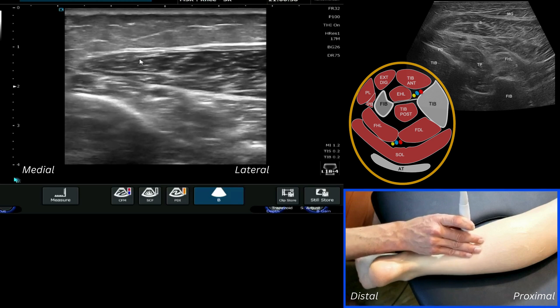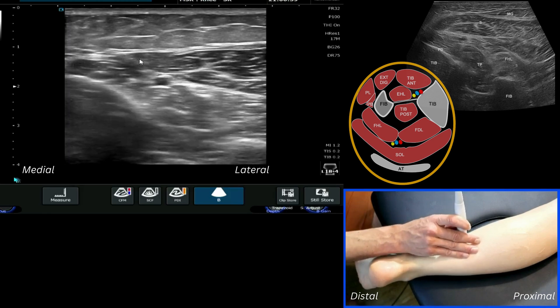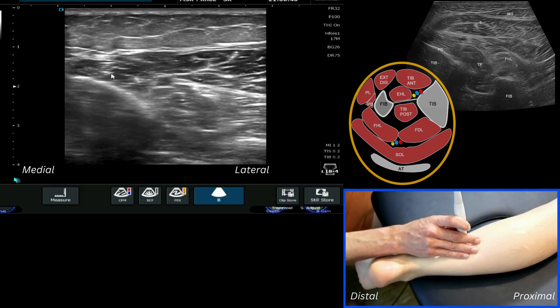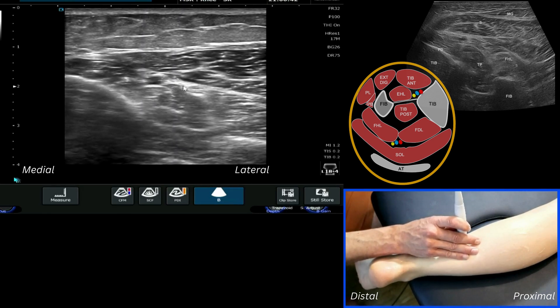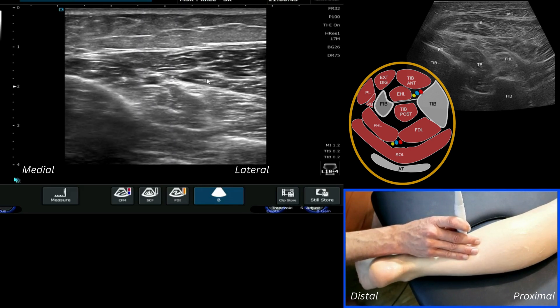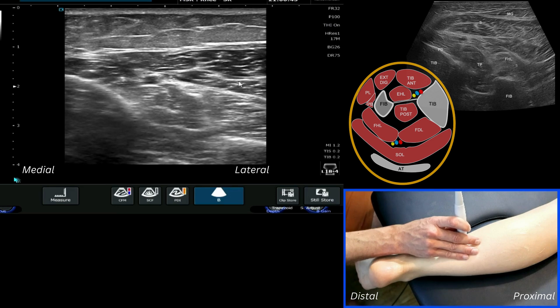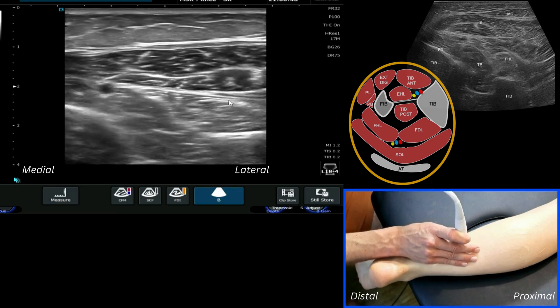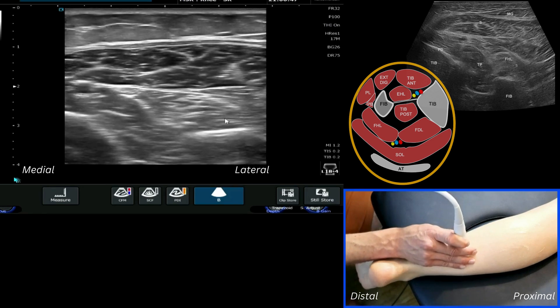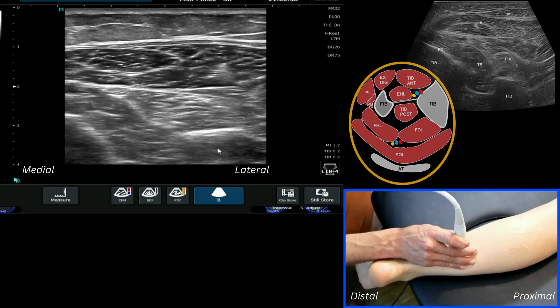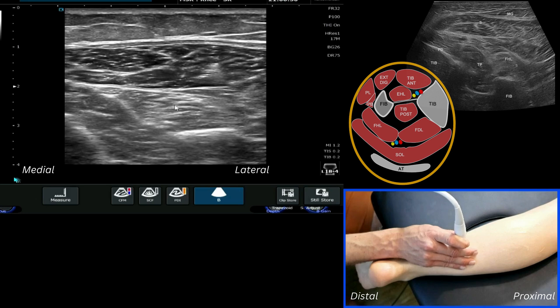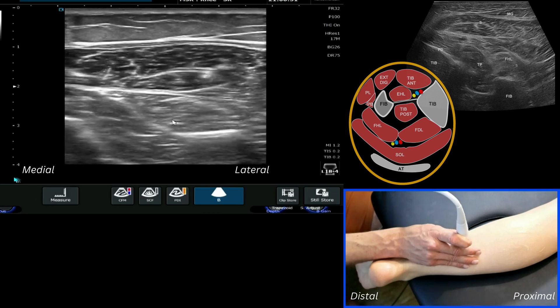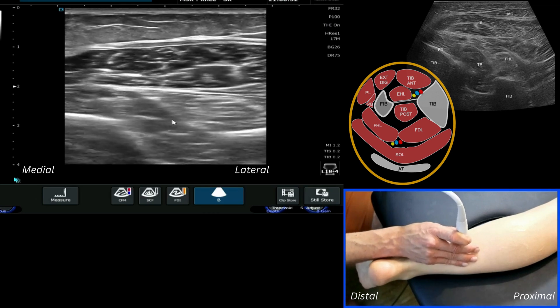So that is how we find that classic view of the posterior aspect of the calf — the deep posterior compartment. We've got digitorum, tibialis posterior, artery, nerve, soleus, Achilles aponeurosis; roll the probe around and you'll also see the fibula and the FHL muscle above it.